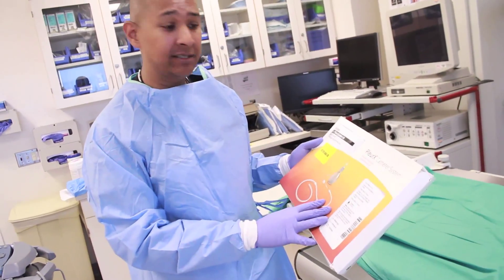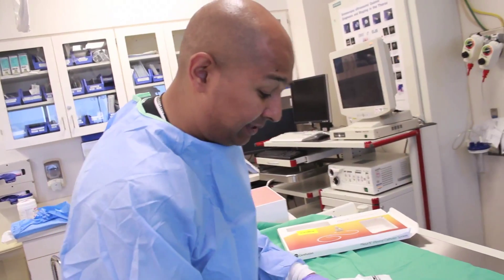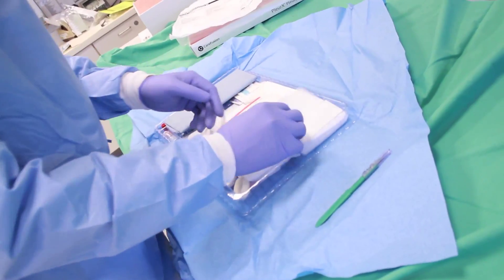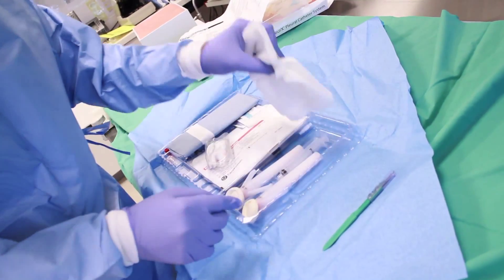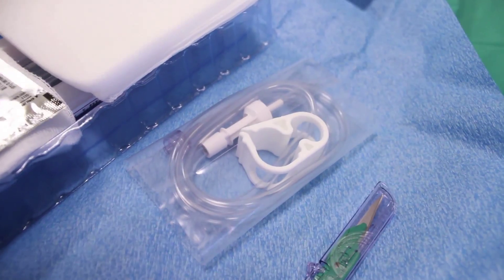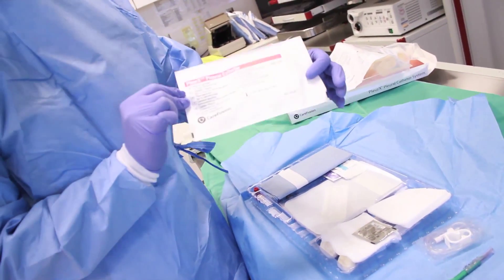This is the pleurex device. We are going to open the kit and run through what comes inside. It's very important for the physician, resident, and student to know what's available. Running through the materials: you will have a scalpel, a dressing kit placed on the patient after the device is inserted, chlorhexidine to sterilize the space, and a connector for attaching to a bottle or tubing to help drain the space. The most important part of this kit is the pleurex catheter itself.